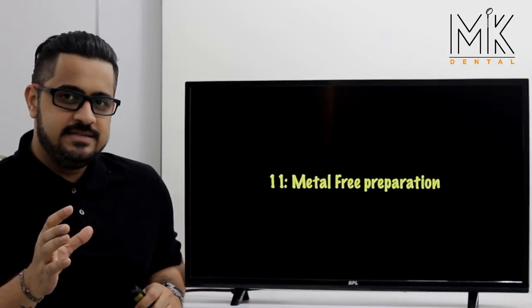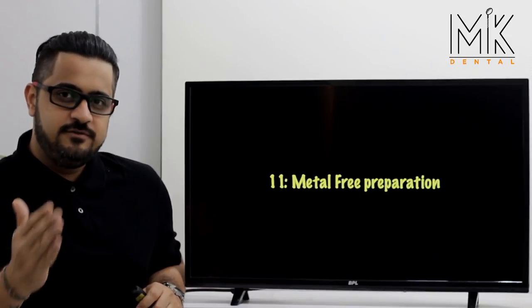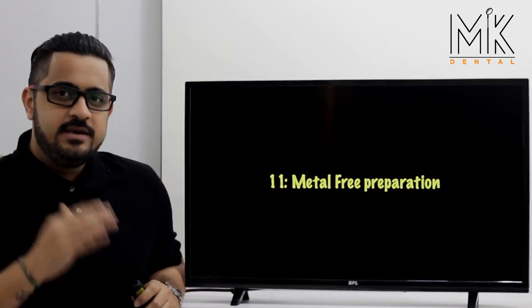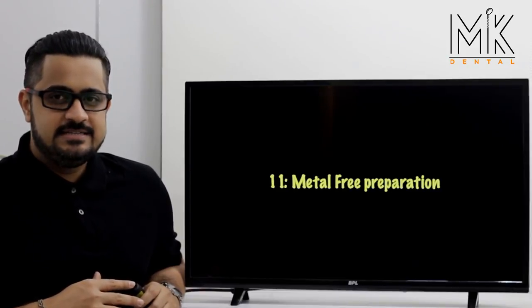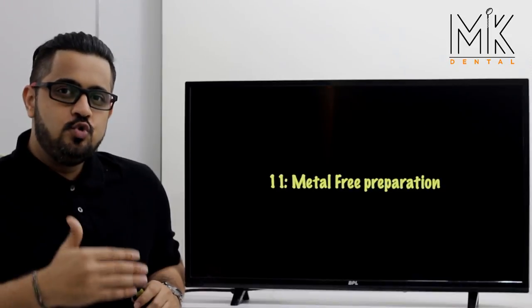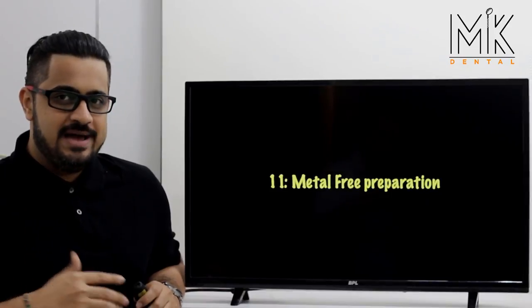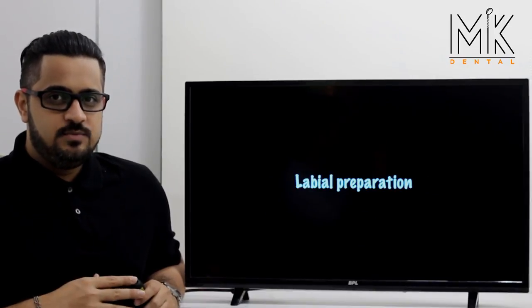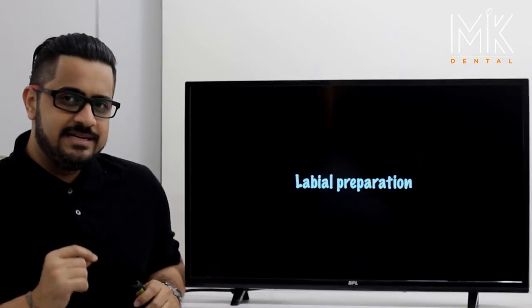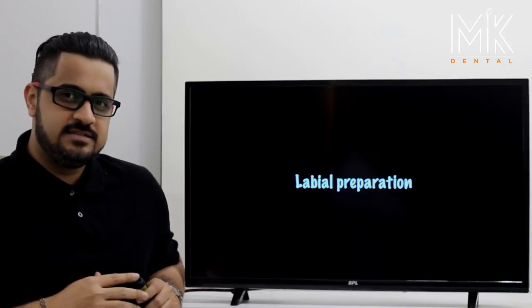The protocol and principle is the same whether this is a PFZ — porcelain fused zirconia — or an e.max restoration. It's important to understand that the labial aspect of every anterior tooth has two or even three planes, which means your preparation also has to be multi-planar. I always start with the labial aspect of the preparation first. From the kit, we pick up the first burr in the metal-free cluster.